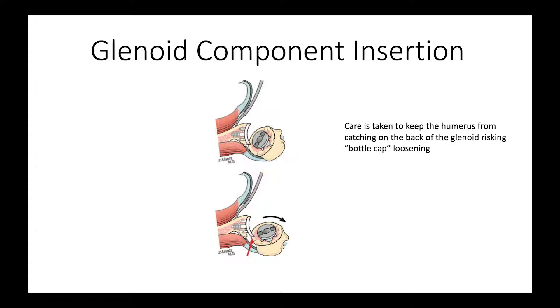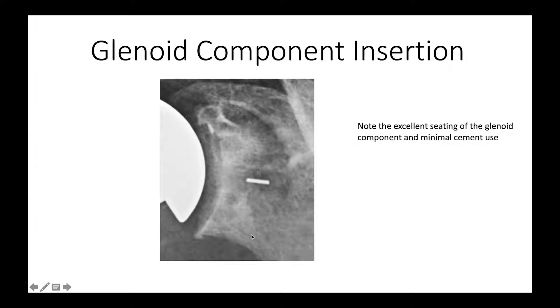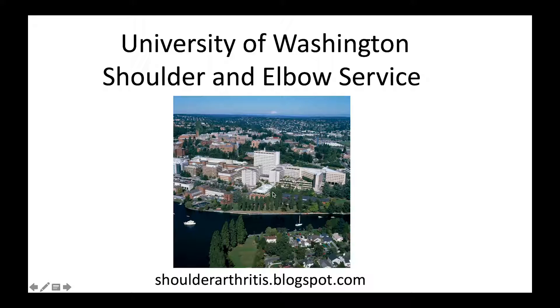One other thing we've learned by hard experience is to be very careful when we rotate the humerus after our glenoid component is in place, to avoid the problem of having the back of the humerus catch the back of the glenoid component and lift it up — we call that bottle cap loosening. Here again is our desired construct: minimal cement, just barely visible around the peripheral pegs, and a well-seated ingrowth central peg.